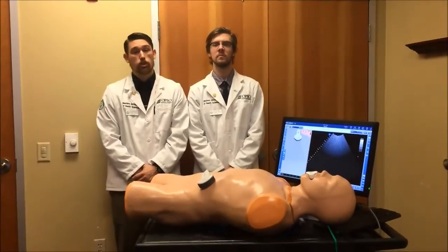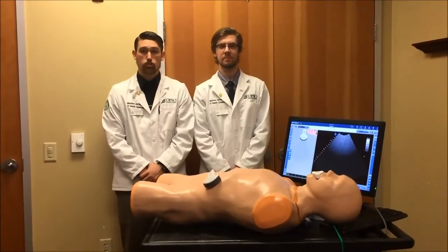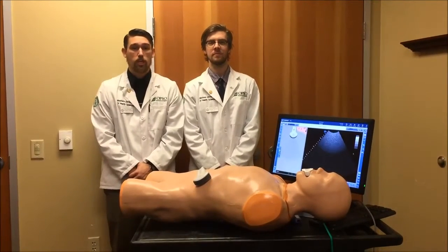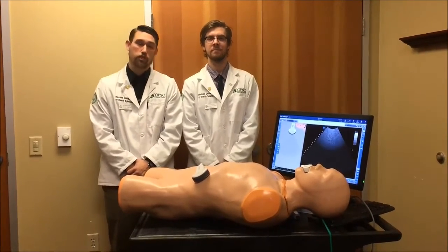This concludes our demonstration on how to identify cardiac structures using the CAE Vimedix ultrasound simulator. We hope this video was educational and informative, and we would also like to thank you for your time.